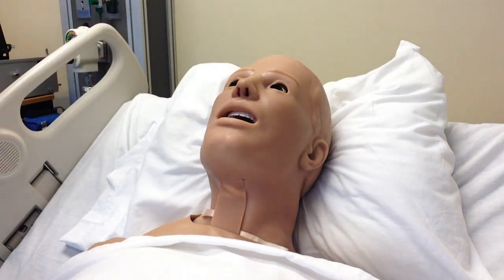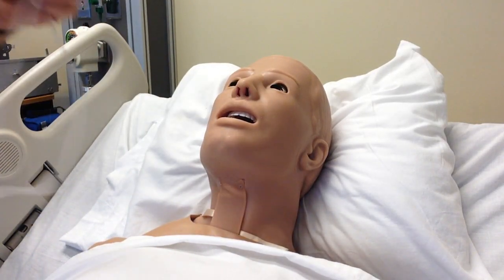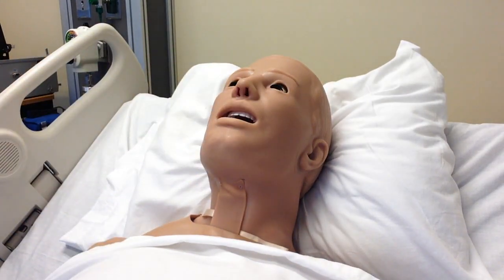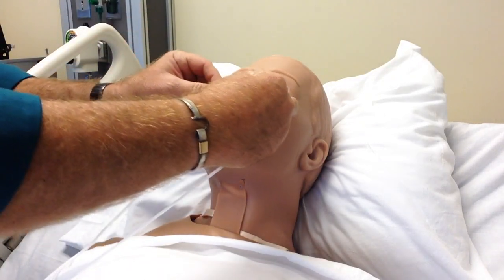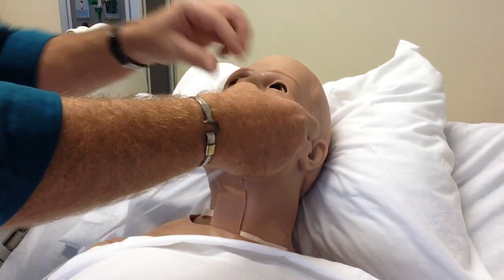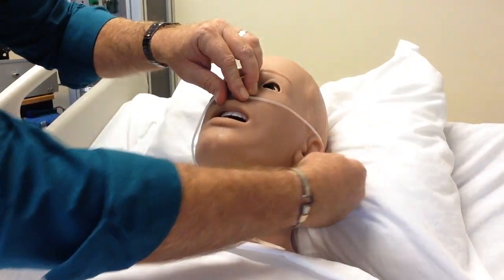So when I have already performed my hand hygiene, I have introduced myself, and have explained the procedure to the patient. Hi, Mr. Jones, how you doing? My name is Dr. King. We'll be placing you on a nasal cannula to give you a little bit of oxygen, okay? All right. This will go up and over the ears.